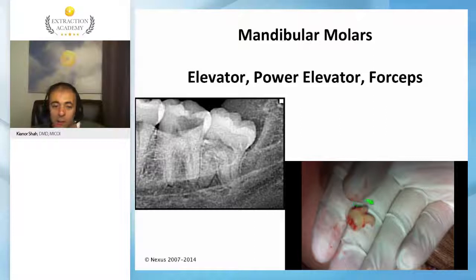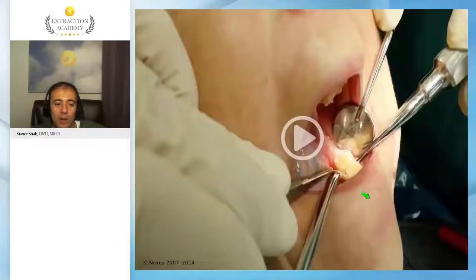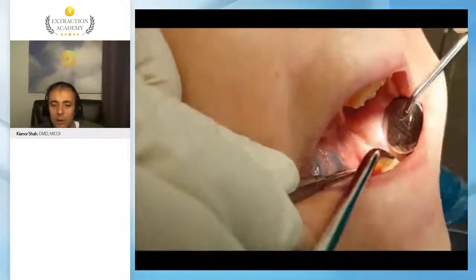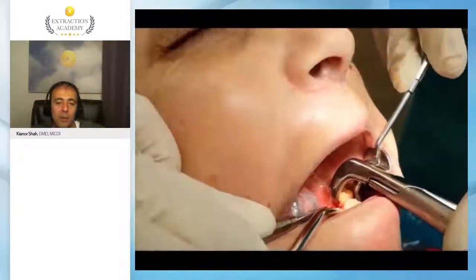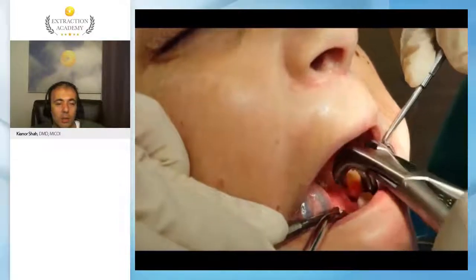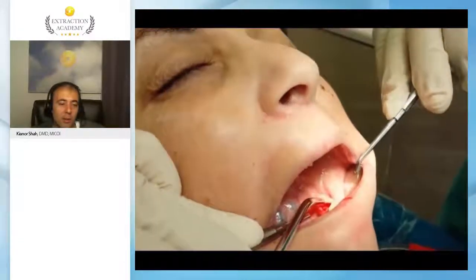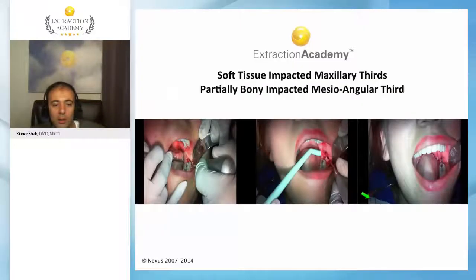I did this case, and I believe I broke the mesial root here, and we had to go back for recovery, or decide to leave it. In this case, I believe I left it because I did not want to cause any damage to the nerve. It was less than 3 millimeters. Usually 2 is recommended, and likely there's going to be osseous integration on top of the root, and you will be fine. So you have to make the decision because there's a lot of debate about should I go after that root or should I leave it and observe it so I don't cause more damage or any damage.